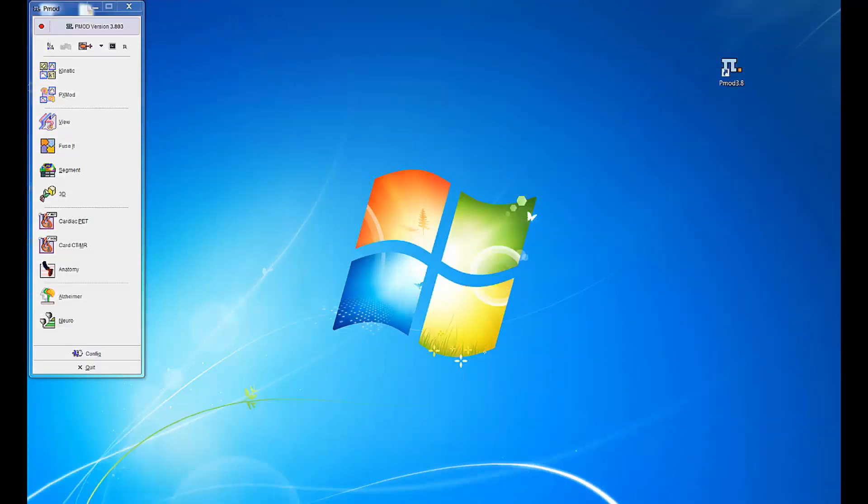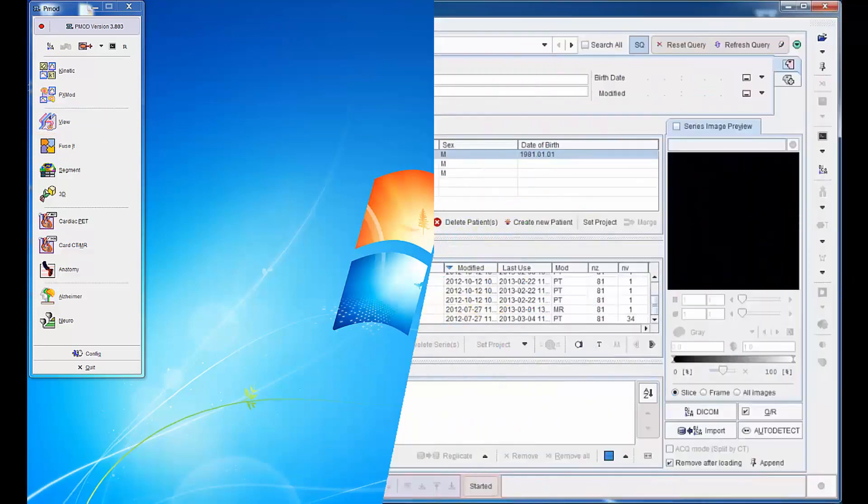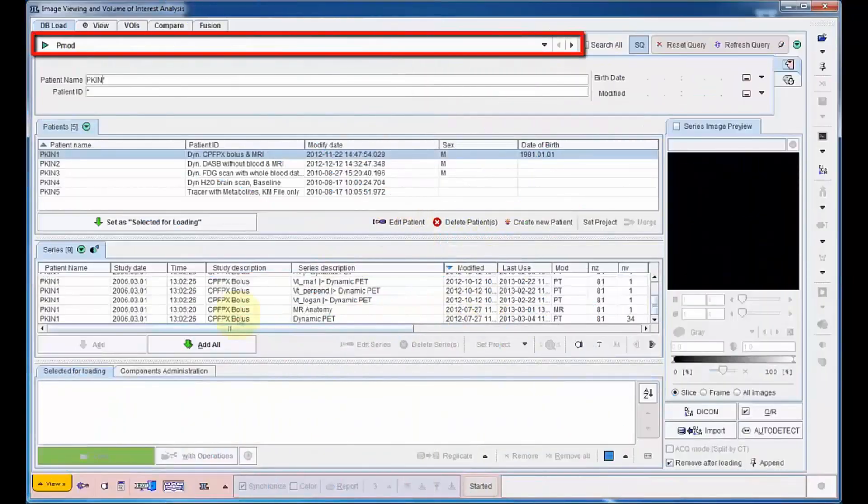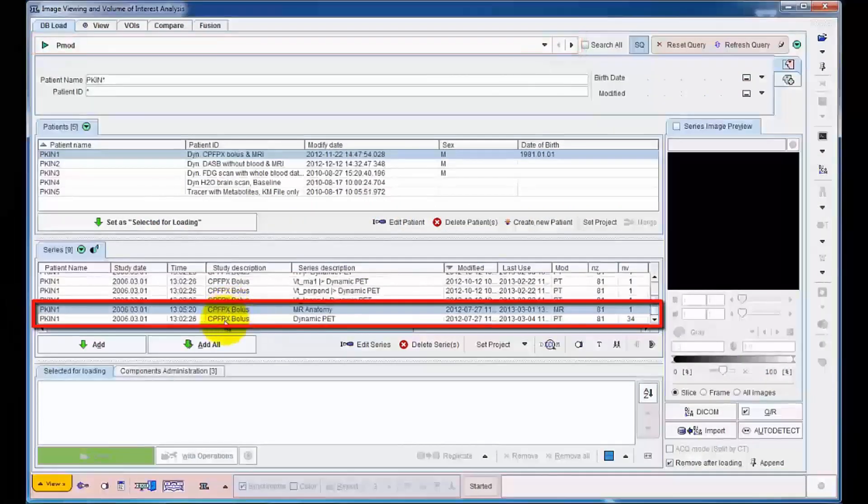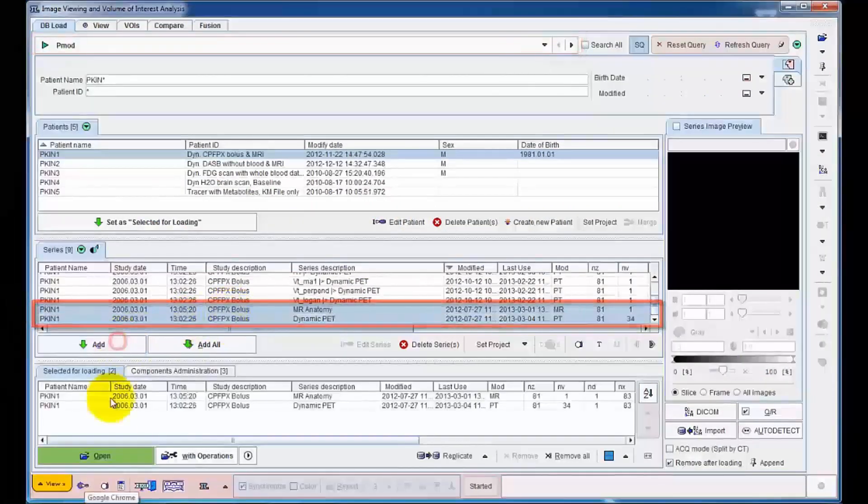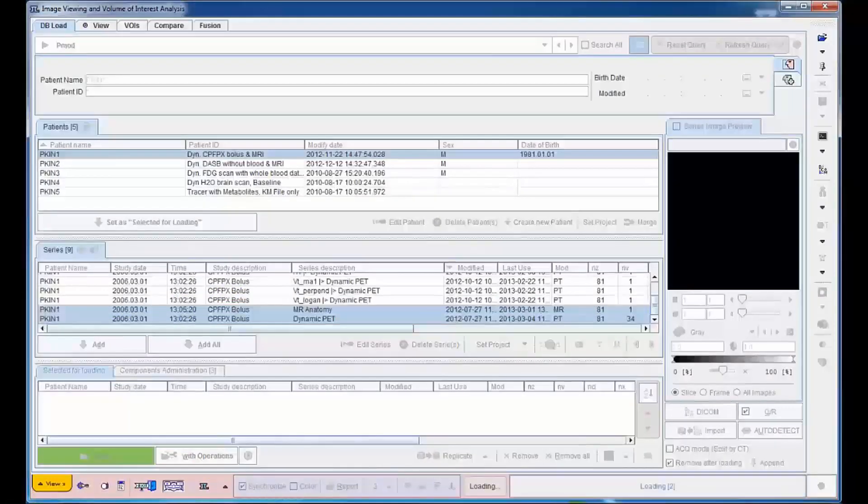After starting PMOD, the licensed modules are shown in a toolbox. From there, the viewing tool can be selected. Our example data is stored in the PMOD demo database. Both the MR image and the dynamic PET series of the patient are now selected and loaded.